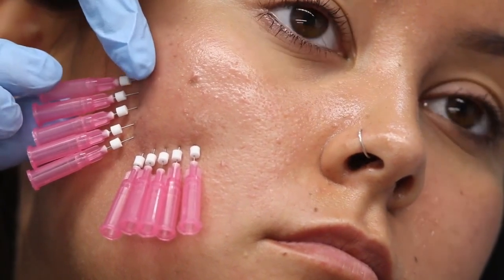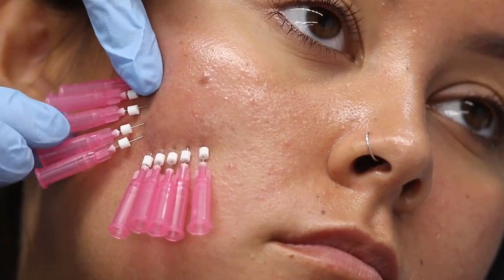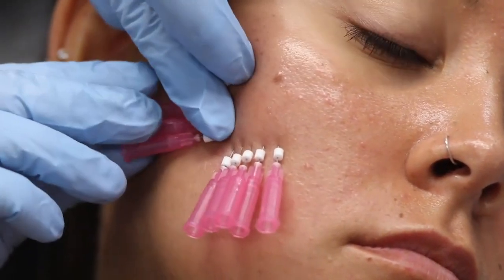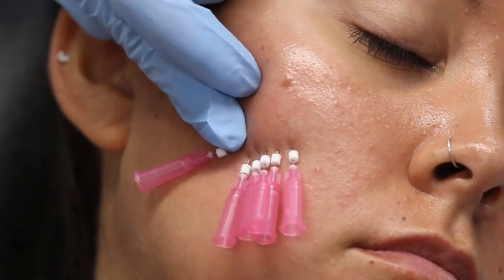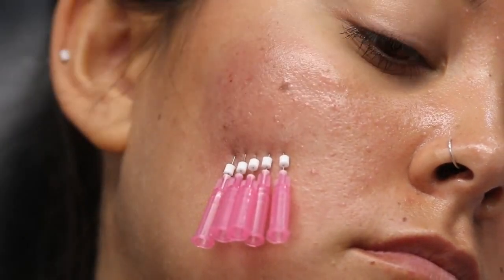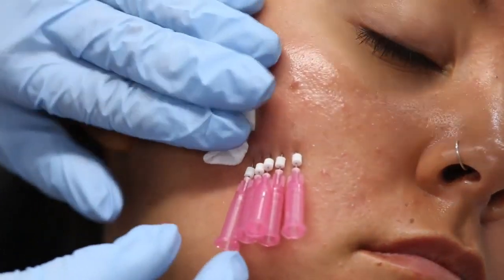Okay, the way you take these out is you are going to turn these 360 a couple times just to make sure that the thread now engages in the tissue, and we want it to stay in the tissue. Come straight out. You can take these out fairly quickly. There's no point in taking them out slow. And now she has this mesh right underneath the skin. And again, that's what's built up this hole.